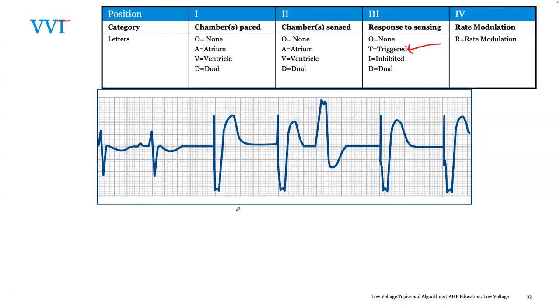And then on the fourth one for us, and again, I'm not sure if you have the luxury, but for this particular group of patients, we would actually ablate the AV node. Now, I know you may not have that. Yes, we don't have that luxury here. Okay, fine. Very important. So I think in this group of patients, it's just a matter of programming VVI, turning on V-sense response, trying to uptitrate their beta blocker as much as you can, and seeing how you go with that. Thank you very much.